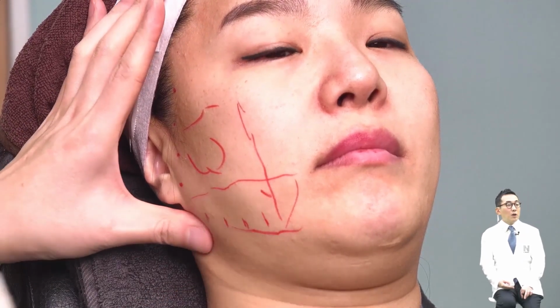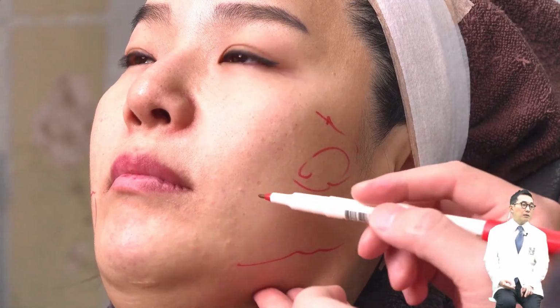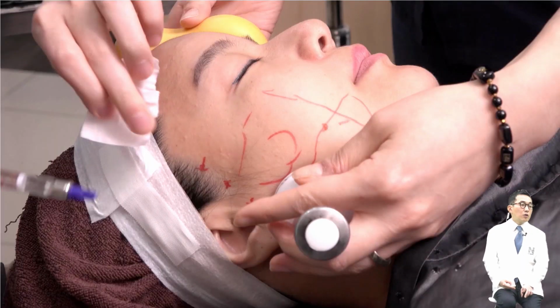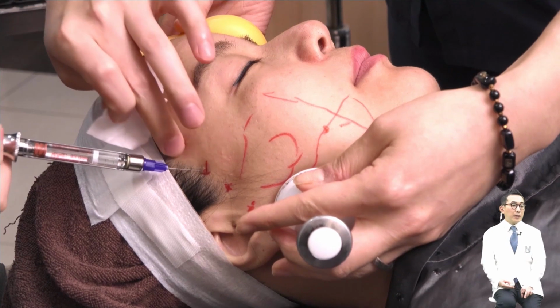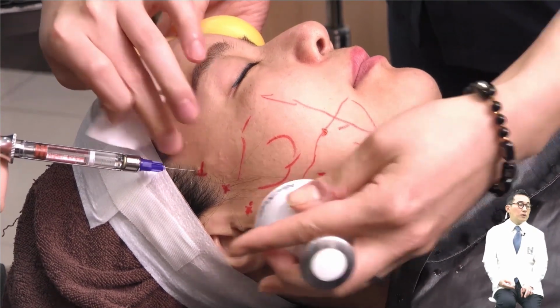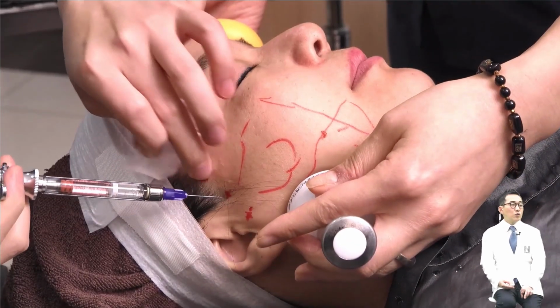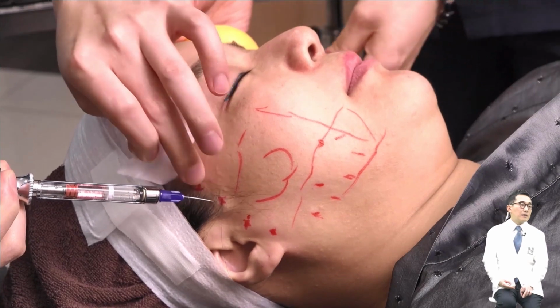So from the upper holes vertically and from the lower hole horizontally. For pain control, rather than tumescent solution, I inject epilidocaine only at the insertion points. To reduce the pain, it is good to use some ice before injecting.